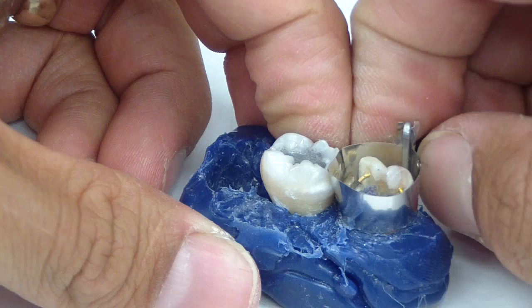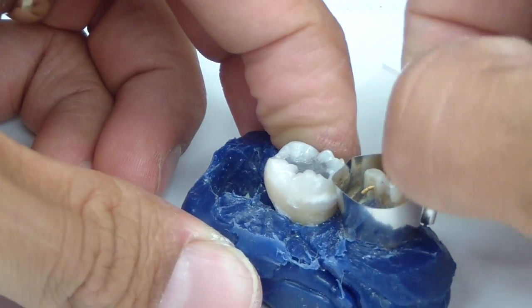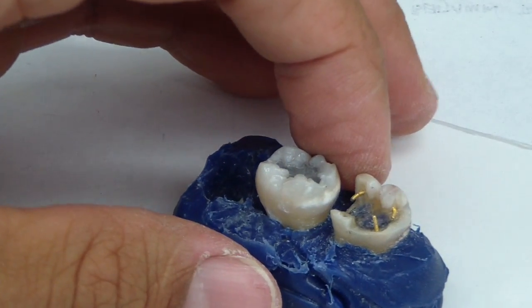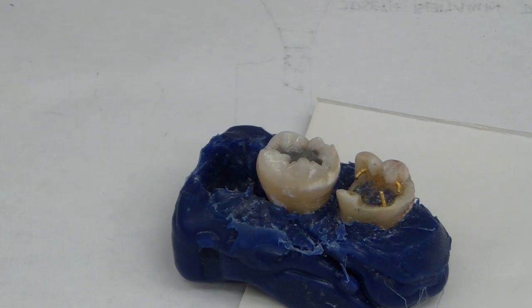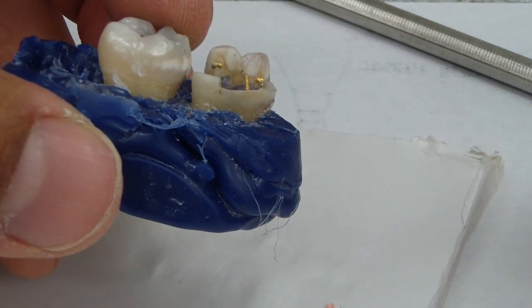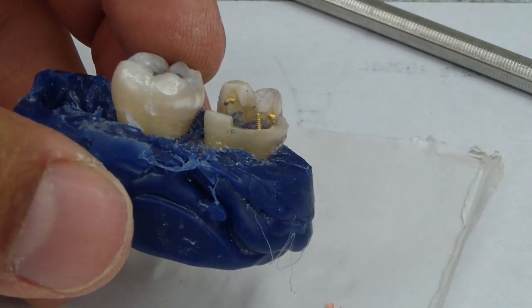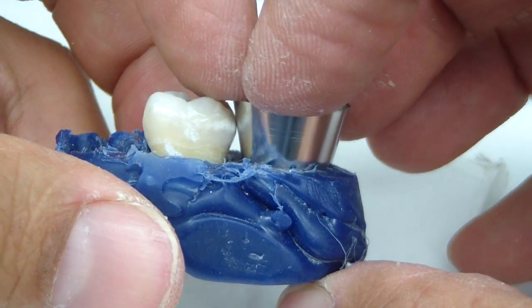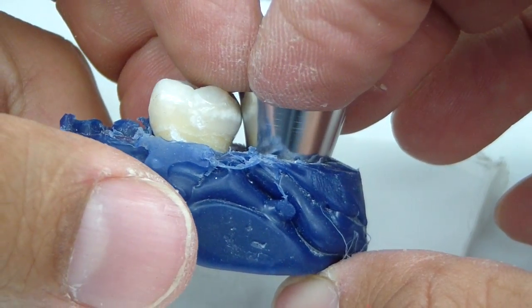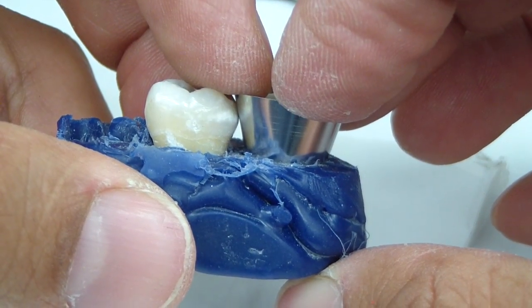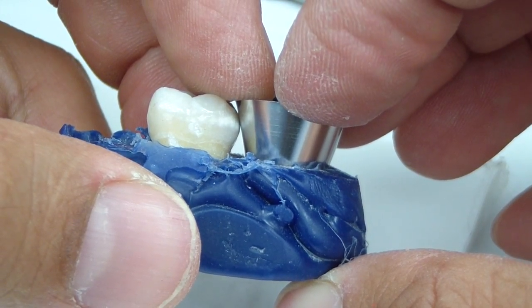So one way you can mitigate that is by precontouring your matrix. So let's compare just a regular matrix, I'm going to use the auto matrix, but essentially it's the same for all of them, Toffelmeyer included. When we place it under the tooth, we get that sort of straight, no contour, straight from the gingival box all the way to our point contact.